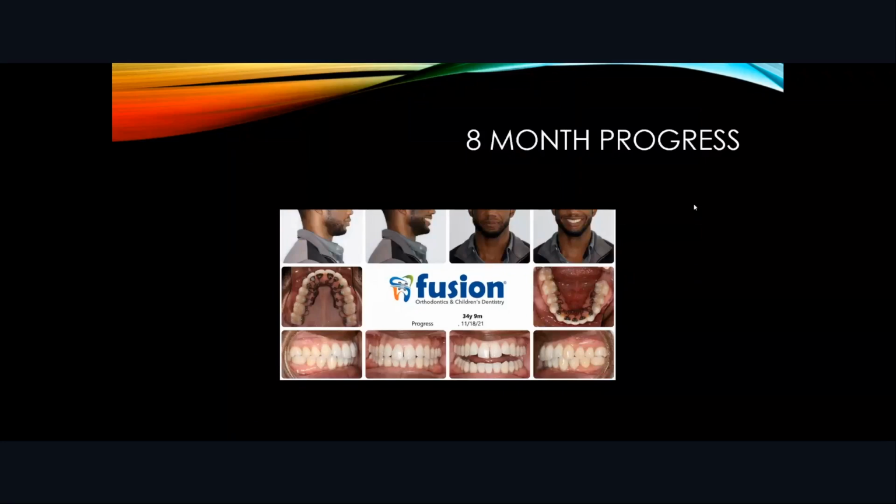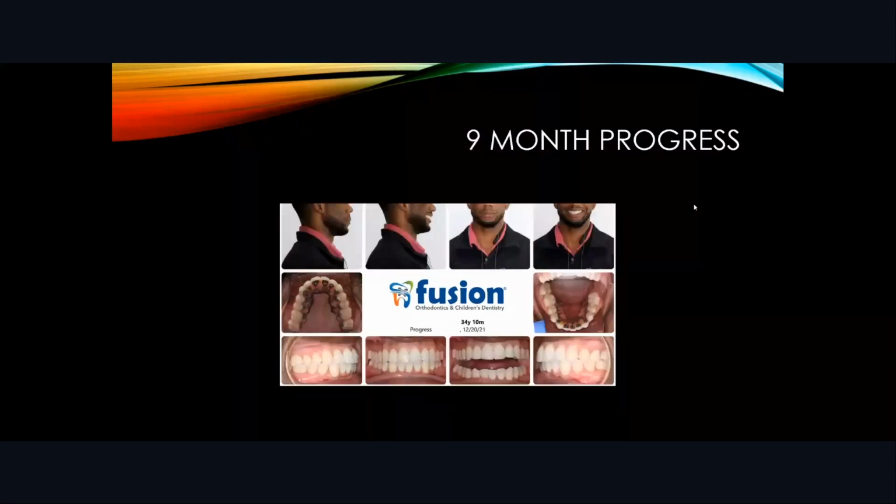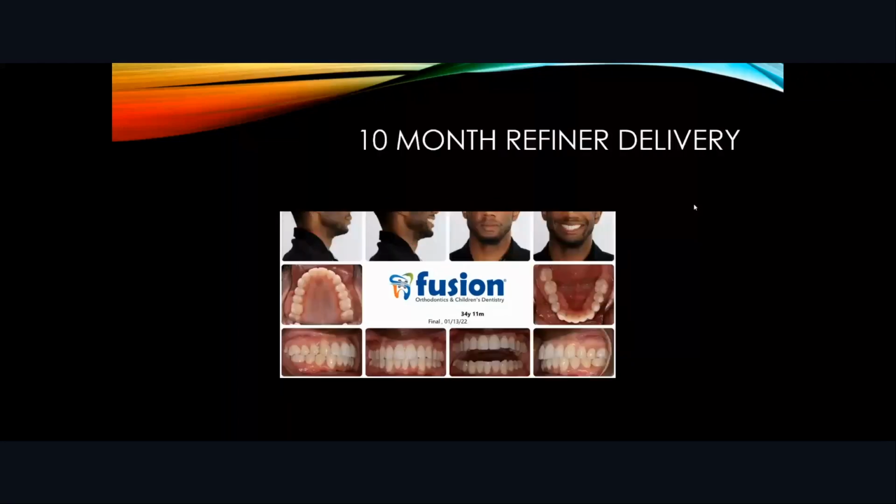8 months into the treatment, the canines are class one, lower arch is pretty much getting there, the uppers are lining up, and then in 9 months, everything's still progressing the way I want. And then in 10 months, this is when I decided to scan for the final aligners to do all the detailing.